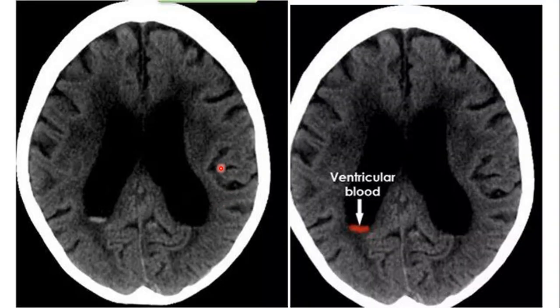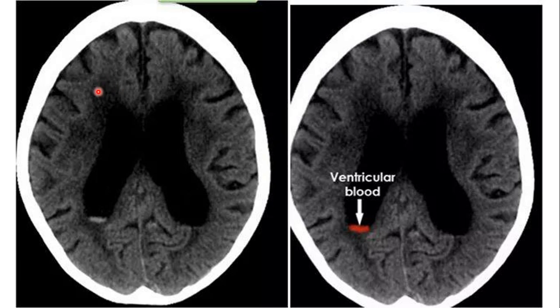Here we see several findings. The cerebral sulci are prominent bilaterally, indicating diffuse brain atrophy — most likely an elderly patient. There is an irregular hypodense area of the white matter in the periventricular distribution around the anterior horns of the lateral ventricle, indicating periventricular small vessel disease. Looking carefully, there is a fluid level — a hematocrit level — indicating intraventricular blood with sedimentation of red blood cells in the posterior part of the ventricle.